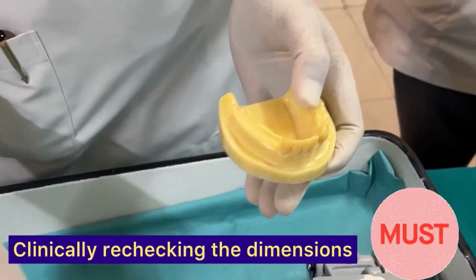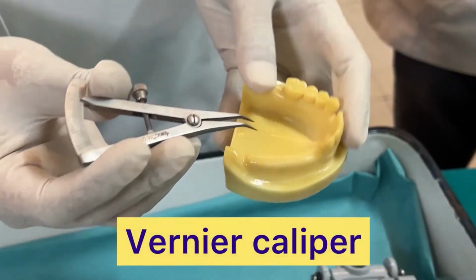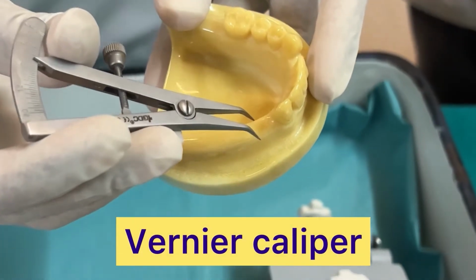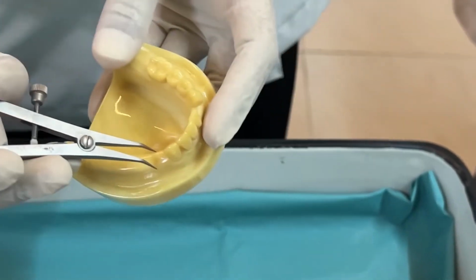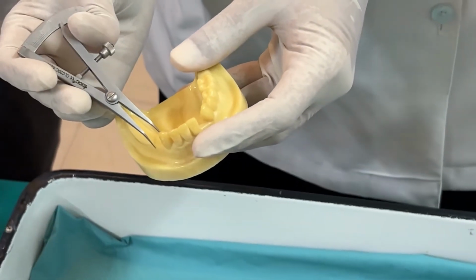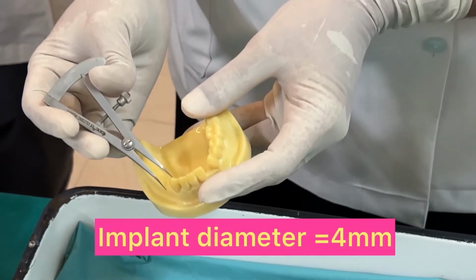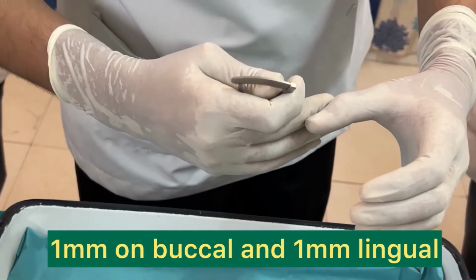So once the flap has been reflected, it is always better that with the vernier caliper we again take the dimension of the buccolingual width. So suppose the buccolingual width is 6 mm, the maximum diameter of implant which you can place would be 4 mm. 4 mm, why? 1 mm on the buccal, 1 mm on the lingual.